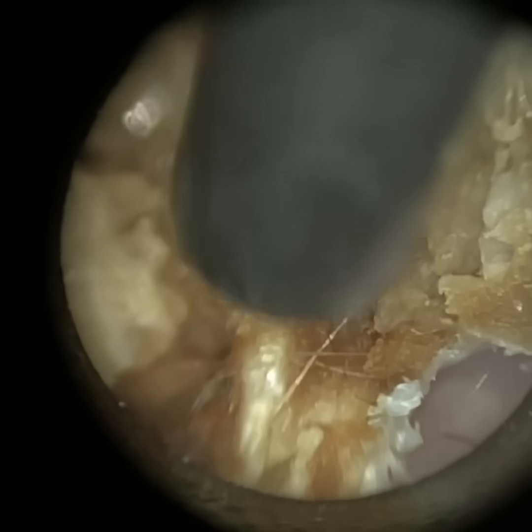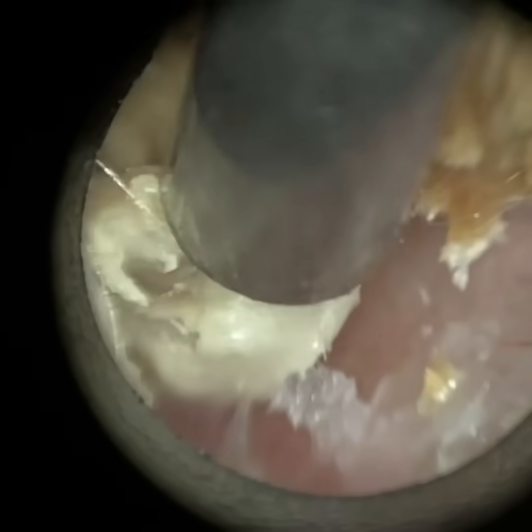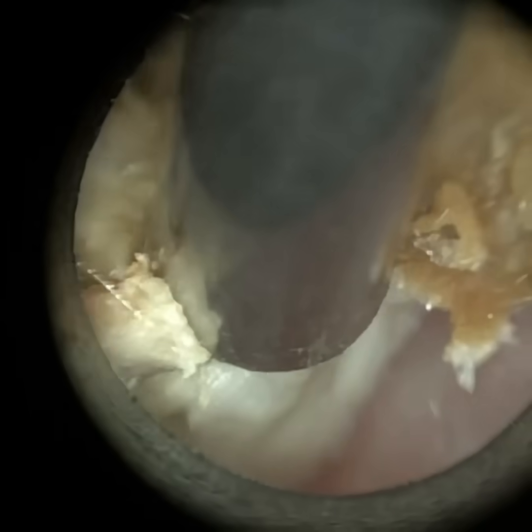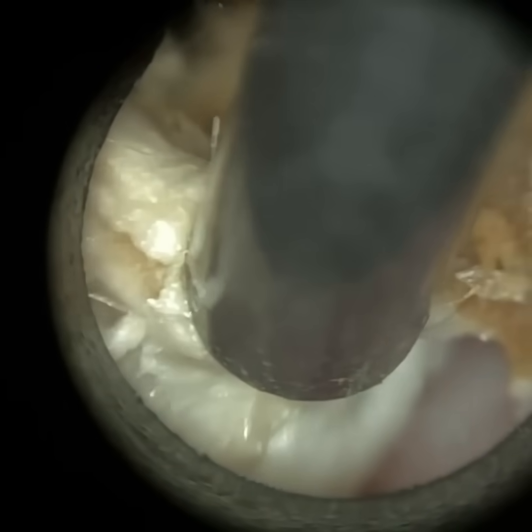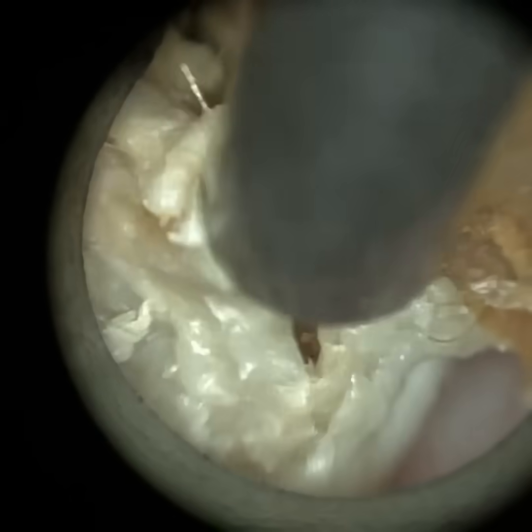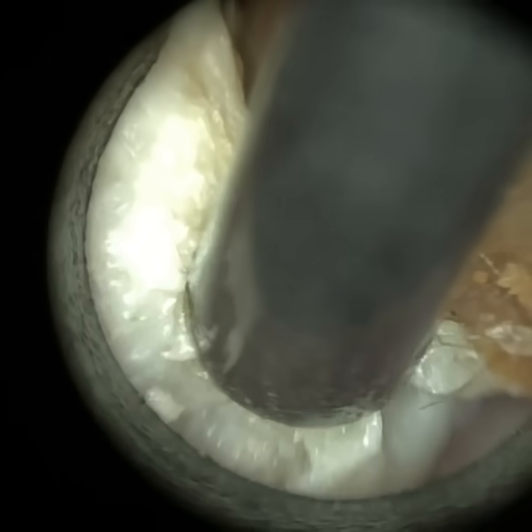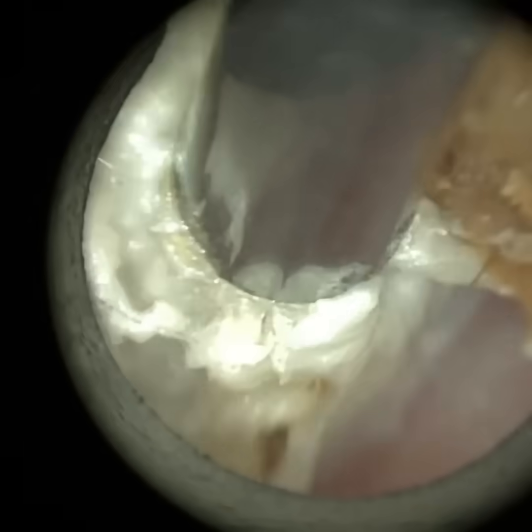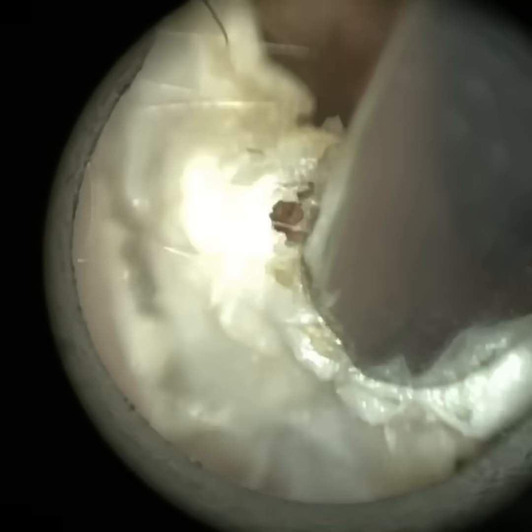You can see the level of magnification — you can see all the hairs that are matted up against this debris. A lot of it is skin adherent to the canal, so we've got to peel it away carefully. The anterior canal wall is a bit of a narrow section in this part of the ear, and this plug is in the last half — probably even the last third — of the ear canal. I'm giving it these little wriggle movements to loosen and mobilise the plug. There's a bit more reflective, silvery matrix on this side — skin that's just recently died and shed.